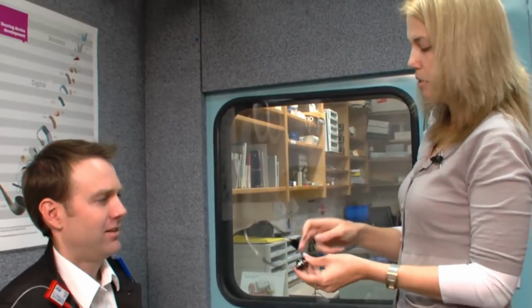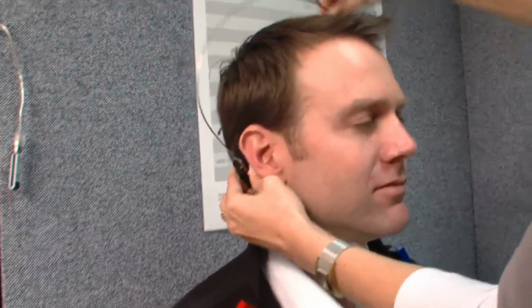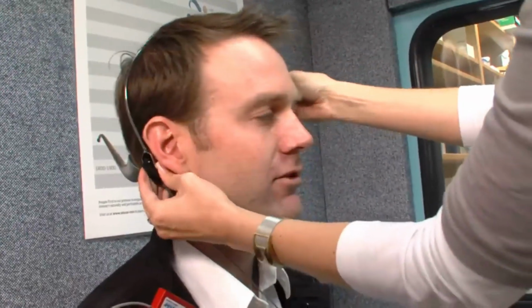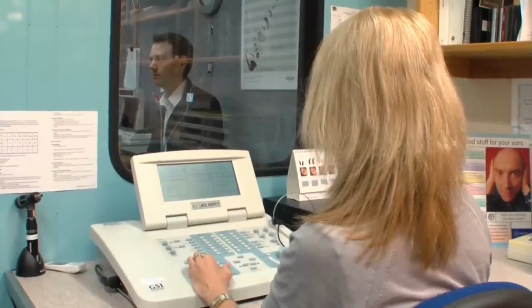What we're going to do this time is put this headband on, and this little box just sits on the bone behind your ear. All you need to keep doing is exactly what you have been doing, just pressing that button whenever you hear the beep. Sure. This time you could hear it in either ear. In the case shown here, the site of lesion is found to be the cochlea itself, rather than the middle or outer ear.